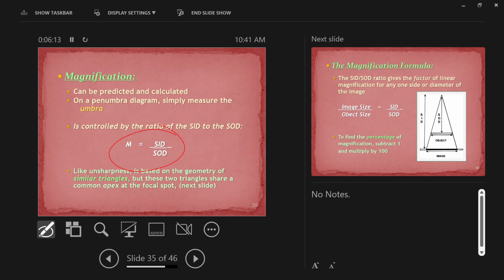Okay? So let's put this to work. The size of the hand, the metacarpal in real life, this is real life. In the real world, the real life metacarpal of the hand is 7.6 centimeters. On this first radiograph, it would be 7.6 times 1.04.